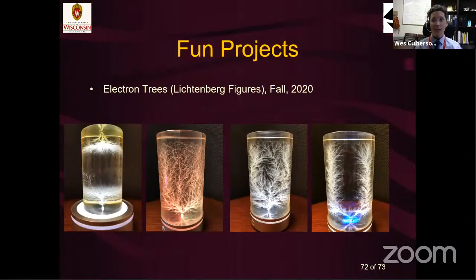I wanted to show you now a fun project from this last fall, because in our lab, we like to horse around and have fun. We got rid of our old Varian Linac, and we decided to have a little fun with it. I don't know if you guys have done this up there. It's a lot of fun. It's very hard to get the opportunity to do it, but if you can pull the target out of your accelerator, put it in photon mode, and use the electron beam itself, it scatters a little bit off the mirror and things so that it creates a wide beam. Put a piece of plastic in the beam, and then if you're able to tune it up just right, you can get basically kilogray dose in a few seconds.